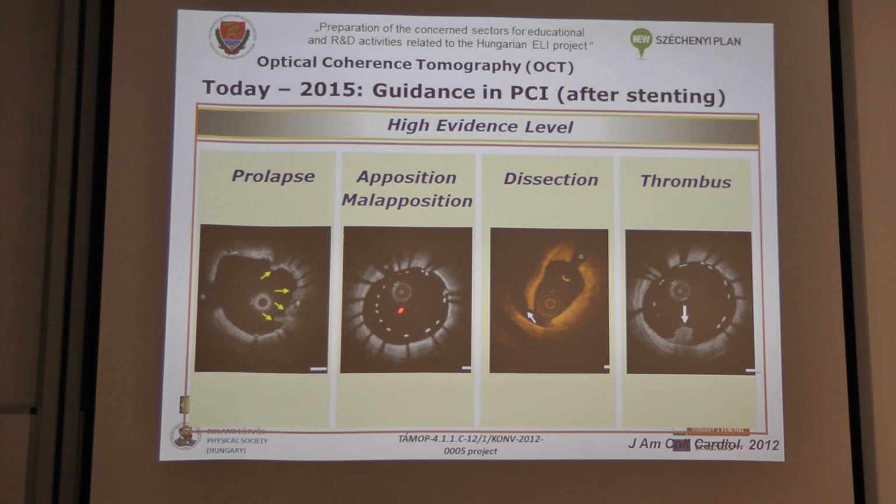And on OCT, if you perform OCT, there are particular studies going on to establish the real diagnostic value of OCT compared to angiography alone, but this requires at least 2,000 to 3,000 patients to examine during the long term in a blinded fashion, to prove its clinical utility.